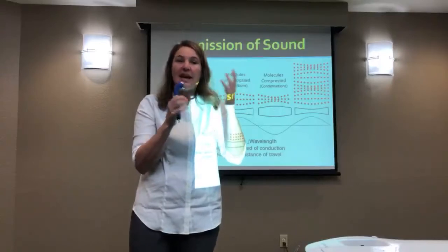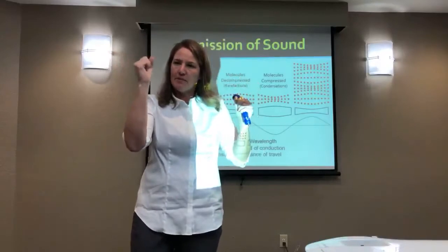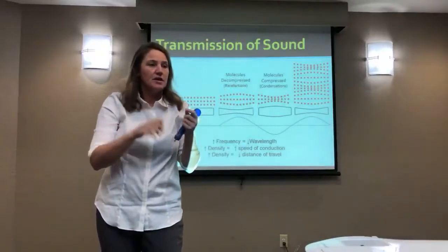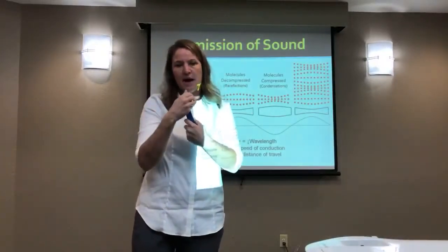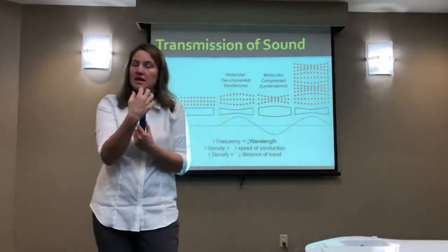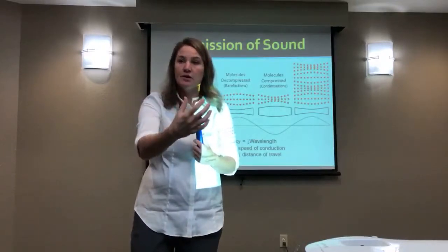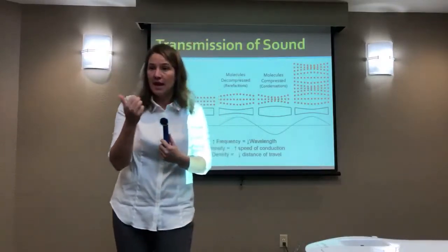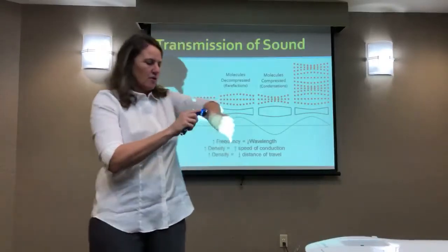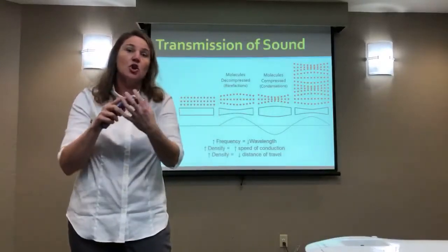Any air, any gas in between, the molecules of a gas are so far apart that the vibration can't affect the next molecule. They're too far apart. So anytime there's something in the pathway of the ultrasound that can't vibrate at the frequency and doesn't have the capacity to pass that energy on, it's not going to transmit. It's going to act as a barrier. So air, gas is a big one. This is why when you couple, you can't be going off the edge. If you get air in the path, ultrasound can't pass. It's got nowhere to go.